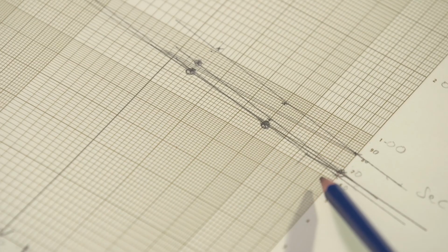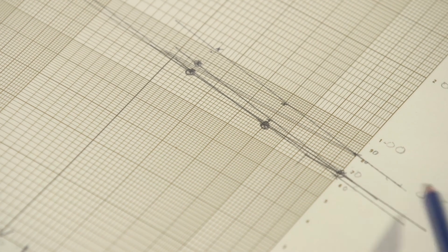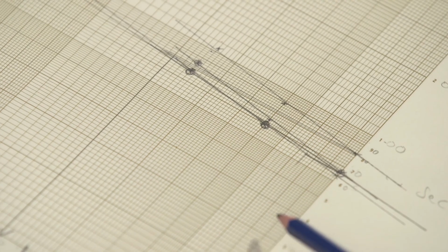The APTT reagent we've used for this factor VIII assay contains a low concentration of phospholipid. It's sensitive to, it's affected by the presence of lupus anticoagulant. So what's happening here? In the 1 in 10 dilution, the antibody is able to prolong the clotting time, a false prolongation. It elevates the clotting time by removing some of the phospholipid sites for the reactions. The reactions run slower, the clotting time is falsely prolonged. So we get a false elevation.